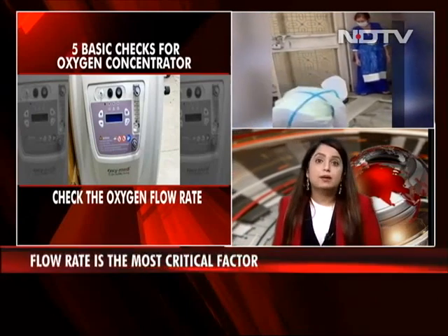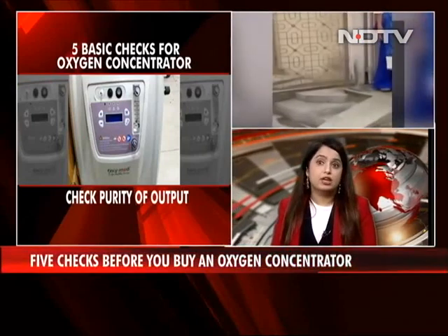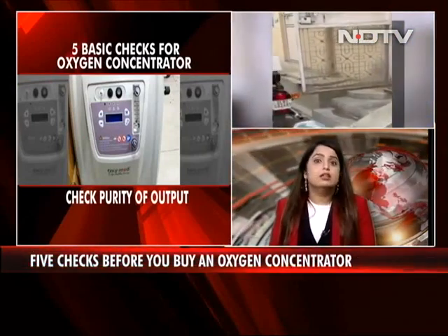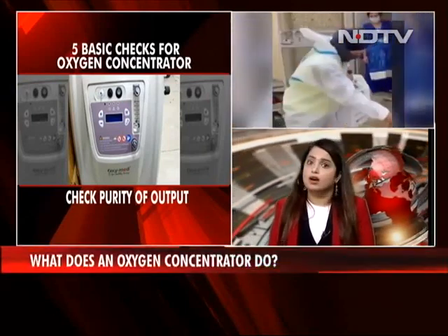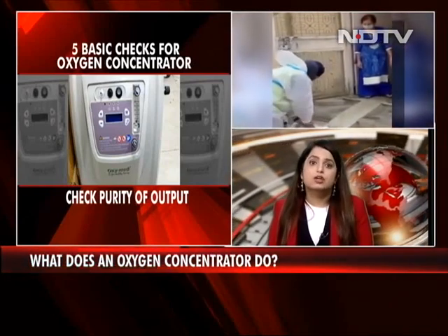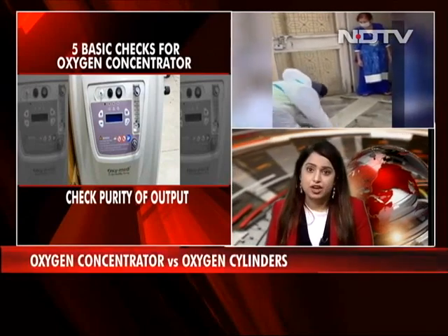Third, check purity of output. Now, the purity of an oxygen concentrator can vary from 85% to 95%. This indicates the purity of oxygen being output by the concentrator. A higher quality concentrator will give you a high flow of pure oxygen, which is exactly what you need, and this is usually indicated by the manufacturer.